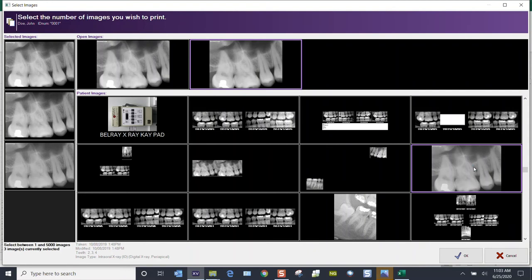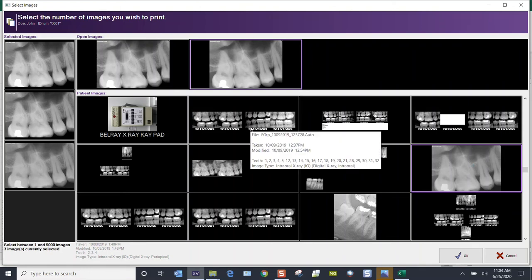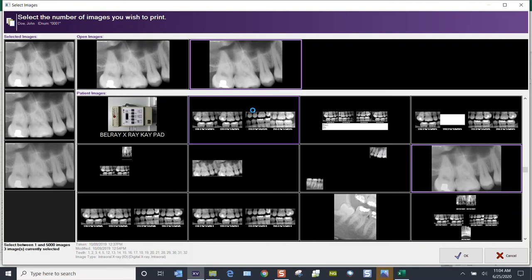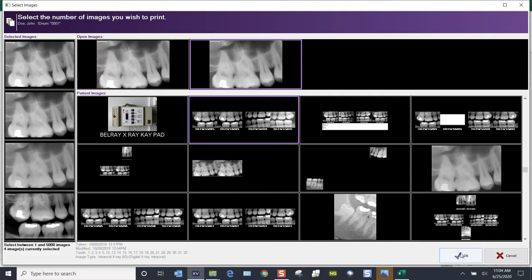And if I needed an image out of a layout, let's click into this bitewing from October 2019. Click into that layout, then click on the bitewing that you need, and click OK in the lower right-hand corner. Now you've got four images selected and you click OK.